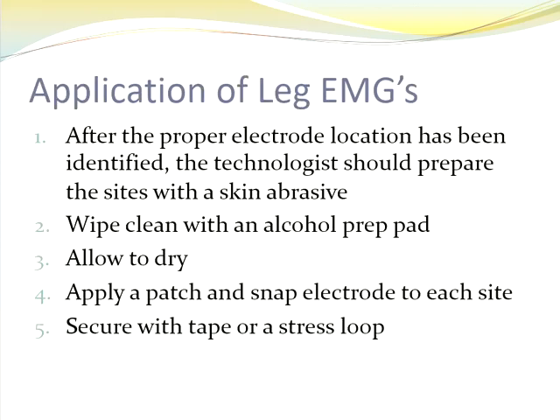Application, same way how we're applying everything else. Clean the spot with a little abrasive. This, you can use the lemon prep. It's not nearly as sensitive of an area, and it's harder to get a good electrode signal because of the distance and the length of the wires. So you do have to scrub a little bit harder for these. So you can use the lemon prep.